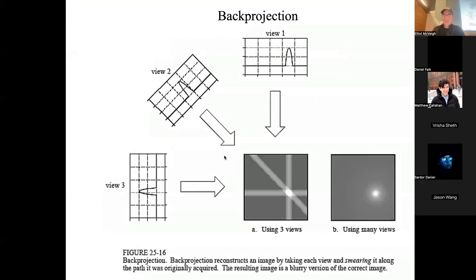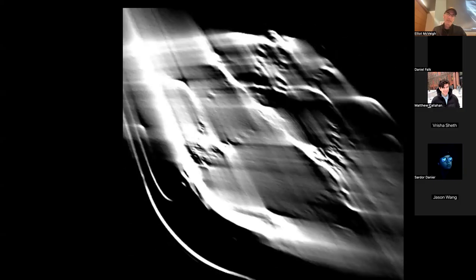So we looked at this example, and this little demo here shows the projection of the g(L, theta) for a specific theta, and then L would be along this direction, right, for this view, and we're projecting all of those values back, and we'll do that for different angles, okay?